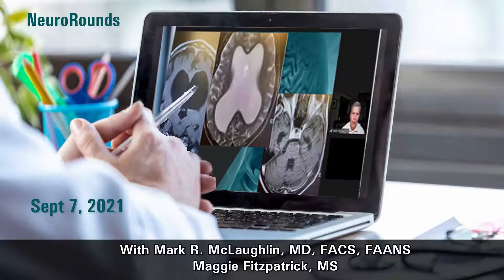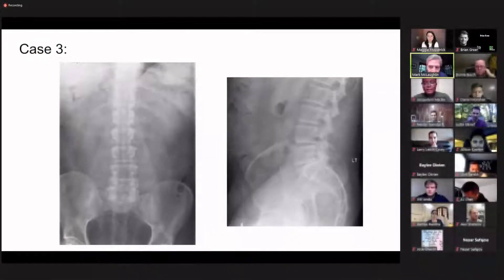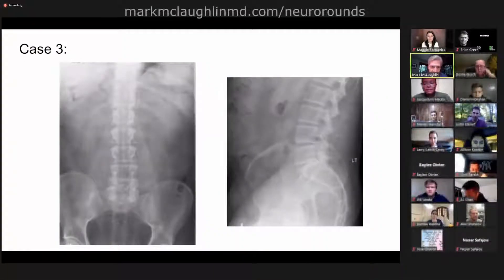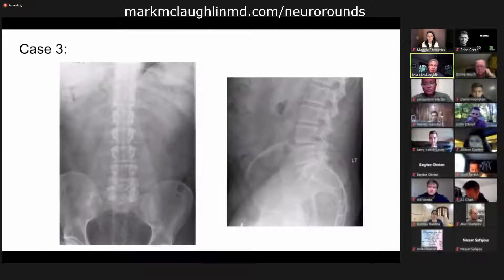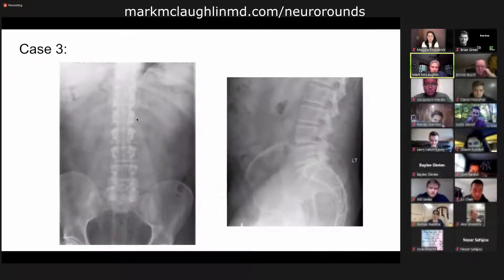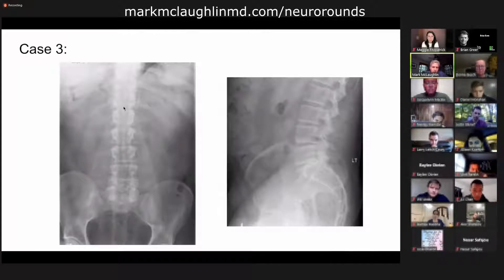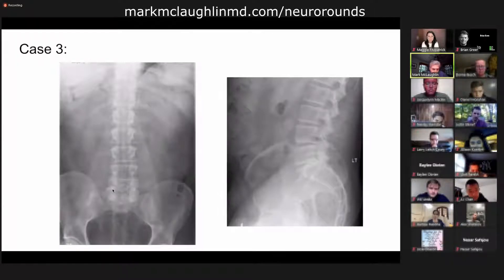Bottom line, when I look at a film, first thing I want to know, particularly as a surgeon, is how many lumbar vertebrae do they have? Because if they have an extra lumbar vertebrae, that can be a real bugaboo with localizing a film in the OR. Here's the transverse process of L1 on both sides here. Here's the rib going into T12 — that, by definition, is the thoracolumbar junction. Then we got L2, L3, L4, and L5. It looks like this person has five lumbar vertebrae. So that's the first thing I want to know.